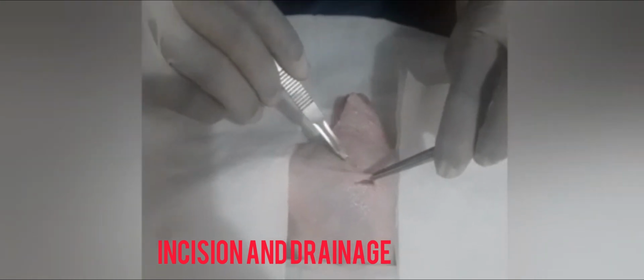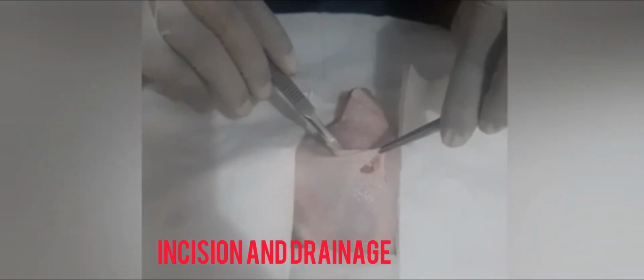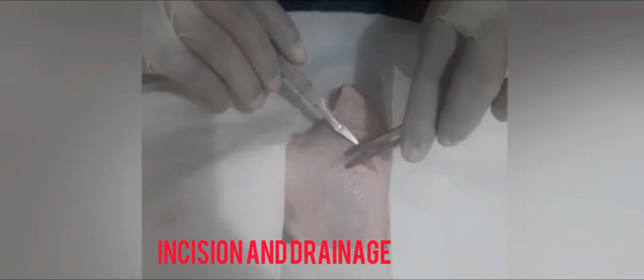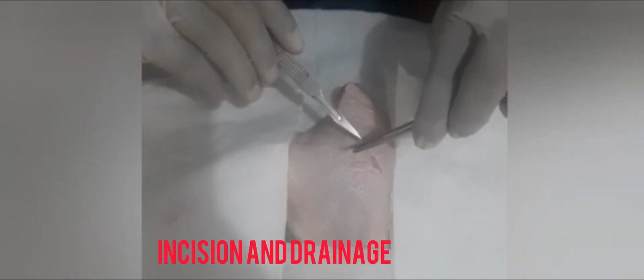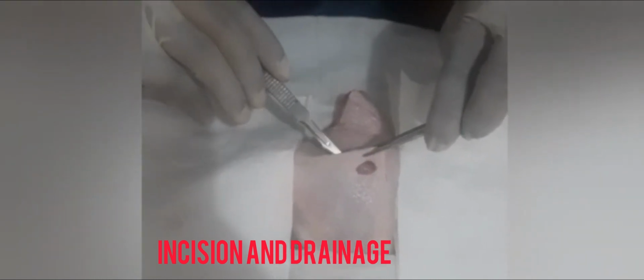Make a V shape on both the edges of the incision. Cut through the subcutaneous tissue within the edges of the incision and carefully remove the skin tag as shown.